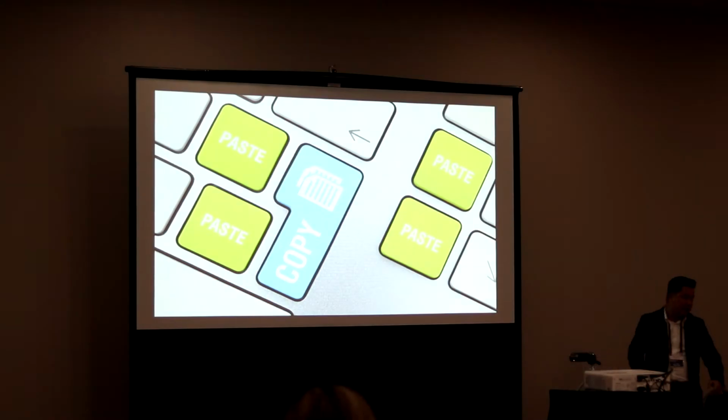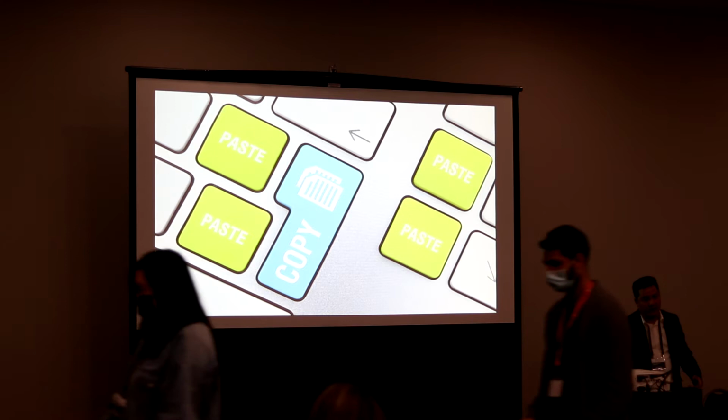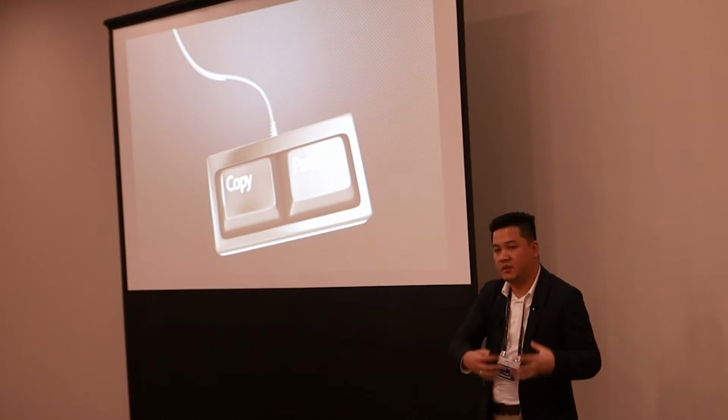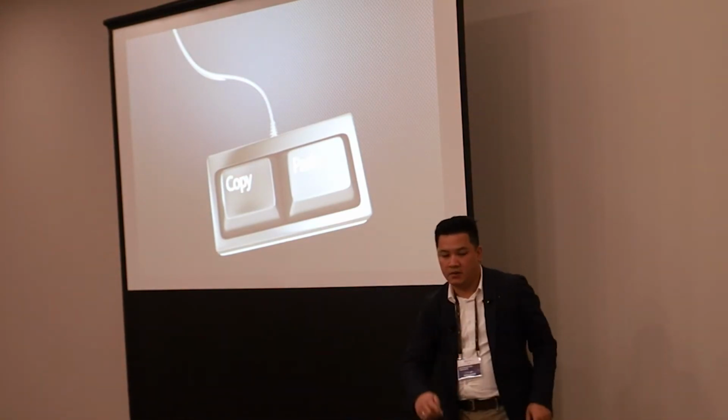So today we're going to be speaking about copying and pasting. It's a relatively simple concept. I mean, everyone is hopefully familiar with this, and how we're going to use this concept to really help us with taking on and tackling complex digital workflows. So copying and pasting is essentially you have a source, some kind of item that you want to take from one spot and you want to drop it into another.